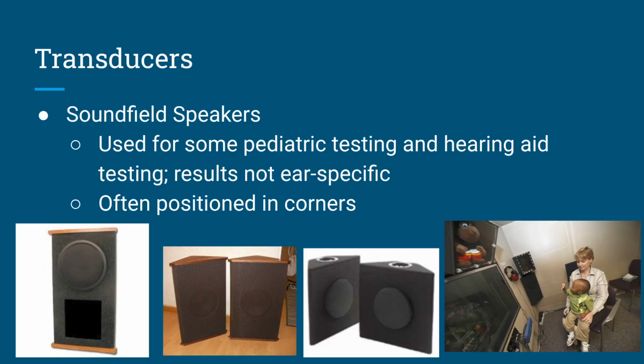A right speaker is not testing the right ear, and a left speaker is not testing the left ear. Yes, you have a head shadow effect, but the better ear is being tested.